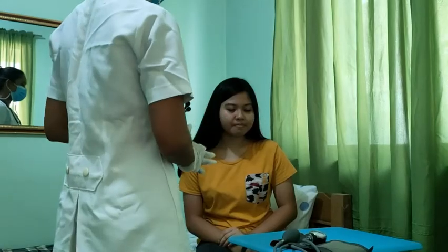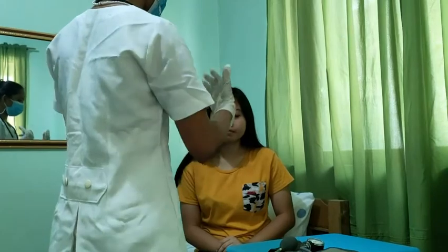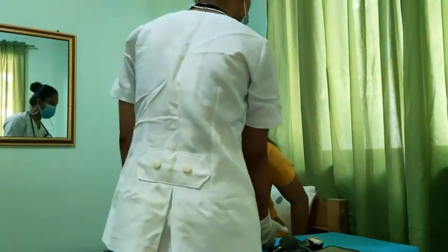Okay. So now, let's assess the heart and blood vessels. By assessing the heart and blood vessels, we should measure the blood pressure, inspect and palpate the precordium, and auscultate heart sounds. This is to monitor the vital signs, especially the blood pressure. Now, ma'am, I will measure your blood pressure. I want you to sit properly and put your left arm here.